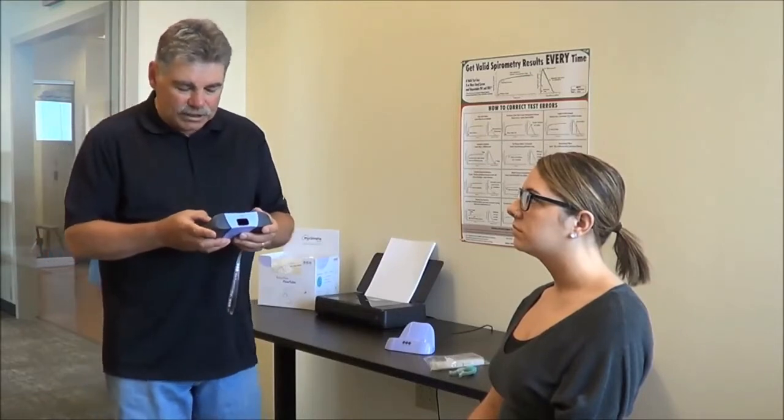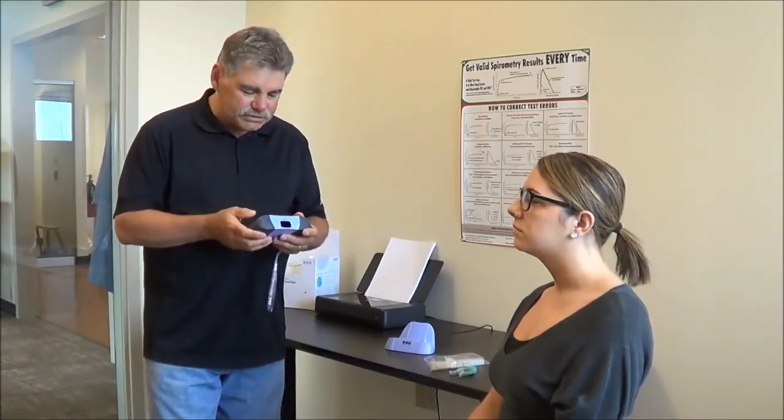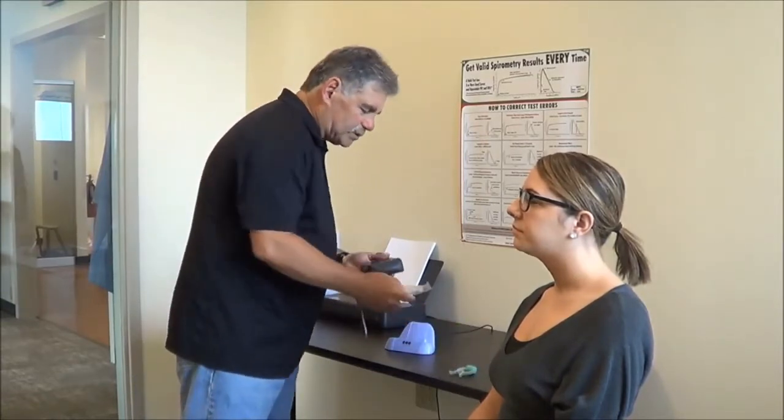However, if the patient is already entered in there, you can simply select them from the database that's there, and there are sort and search features available to do that. So in this case, I'm going to choose Tina, who's already loaded, and we're going to start preparing her to do the test.